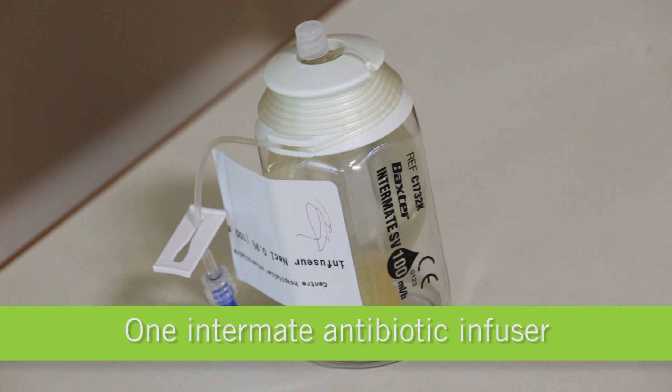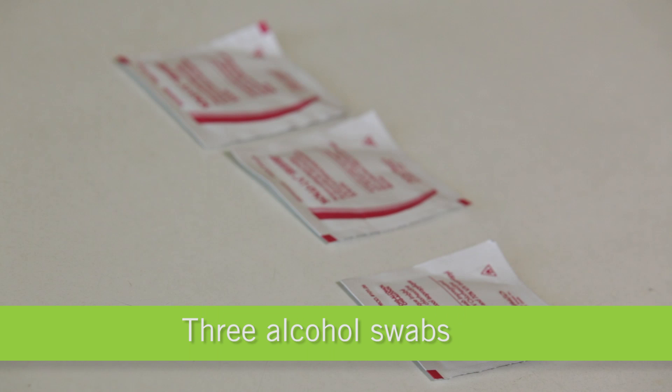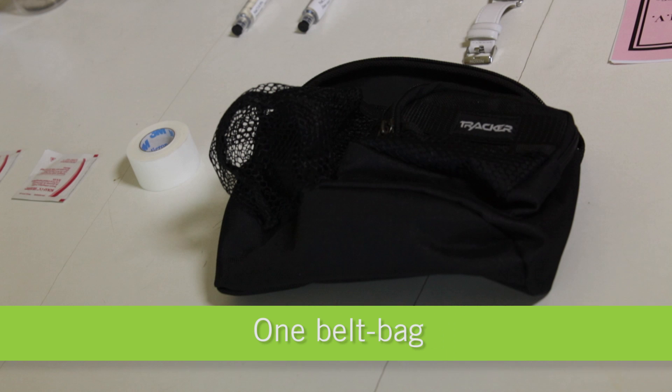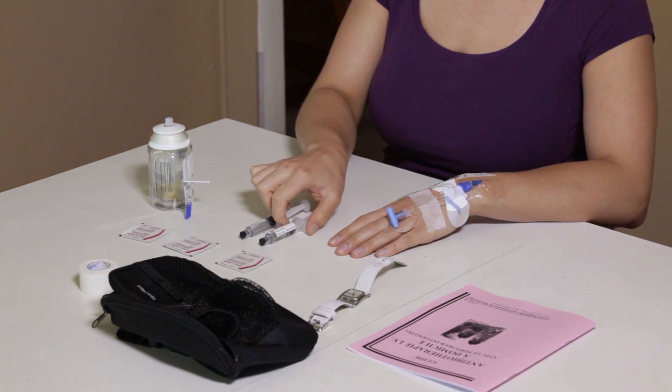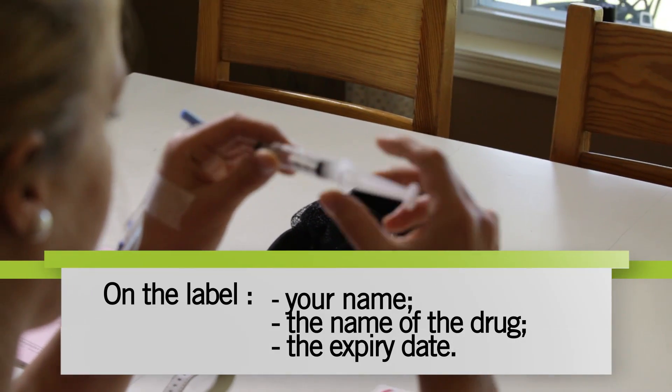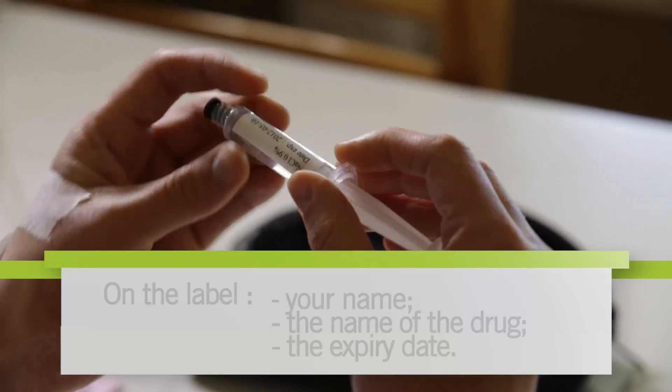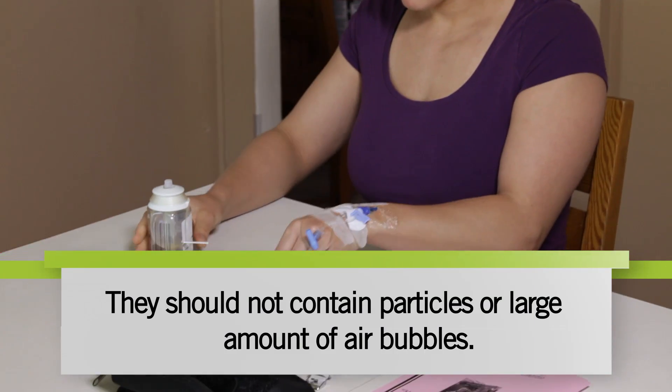You'll need one Intermate antibiotic infuser, two saline solution syringes (also referred to as NaCl and physiological serum), three alcohol swabs, tape, and one belt bag. Before administering the antibiotics, always check the label carefully to ensure it's correctly identified with your name and the name of the medication. Also check the expiry date—your medication must not be outdated.